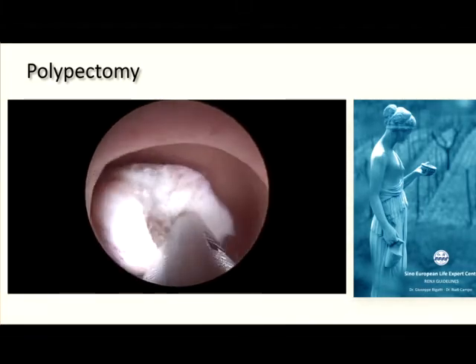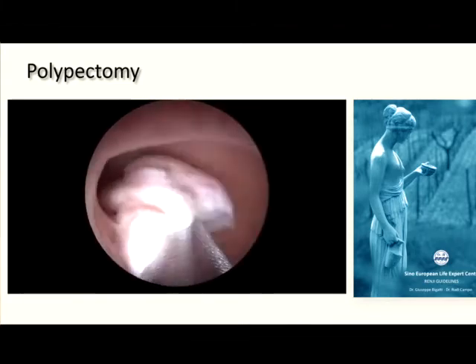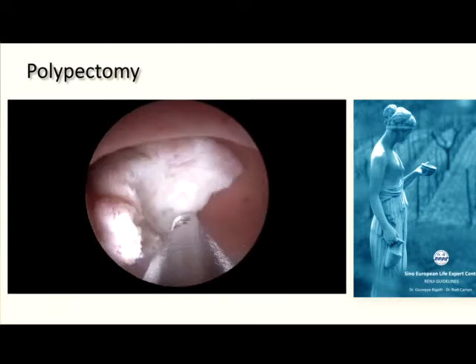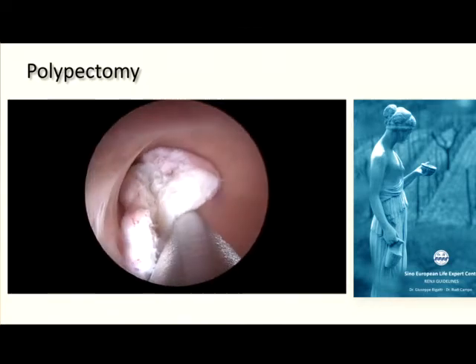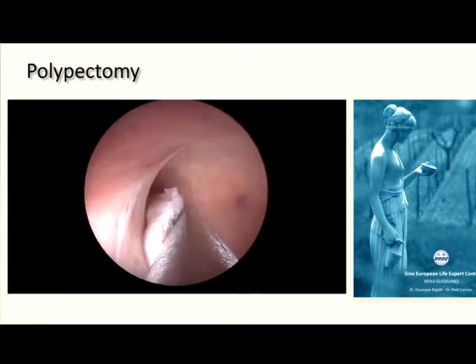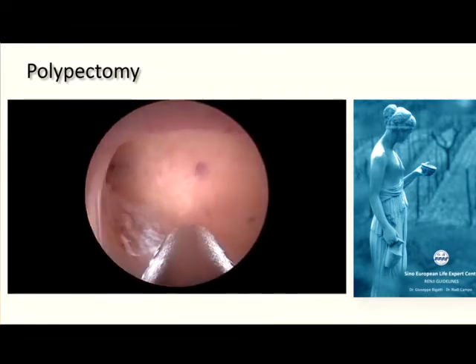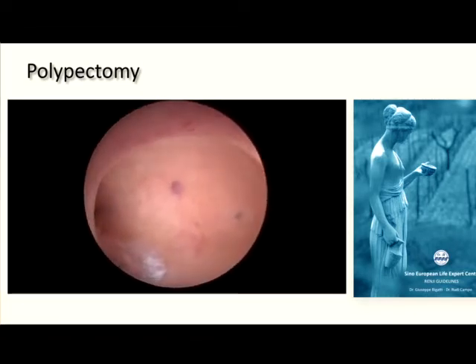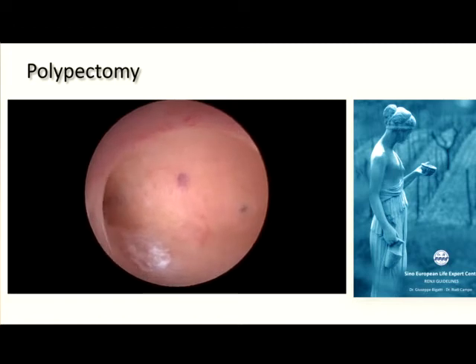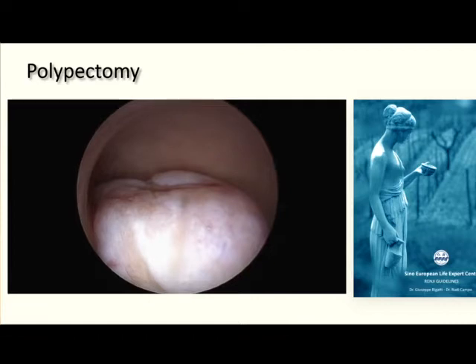It's important that you use a suction of 250 milliliters per minute on the Endomat LC at a speed around 2100 rotations per minute, which means the oscillating movement made by the inner blade inside the outer tube. As you see, you go on the top, you just activate the blade and you reach the base in a few seconds. So a polypectomy in the majority of the cases lasts only a few seconds.